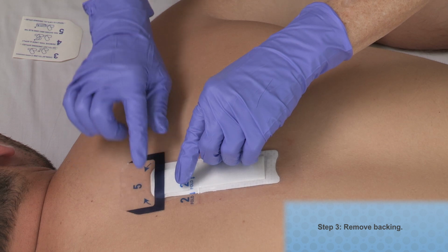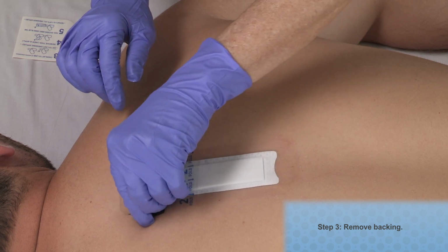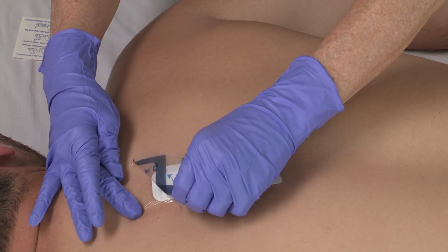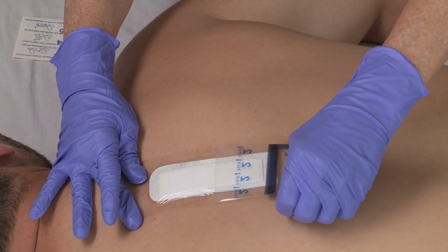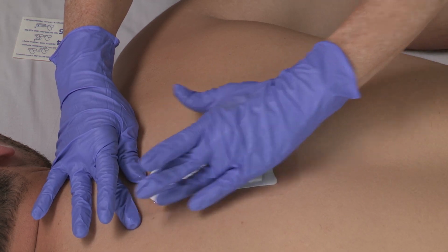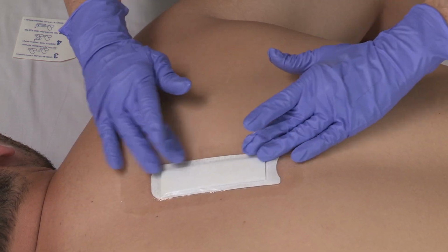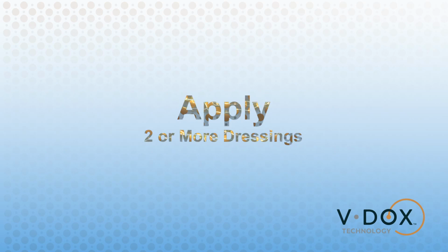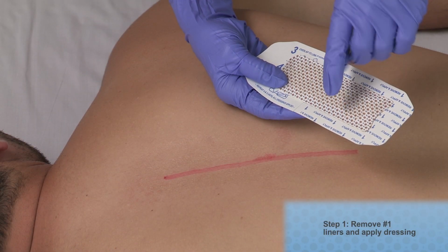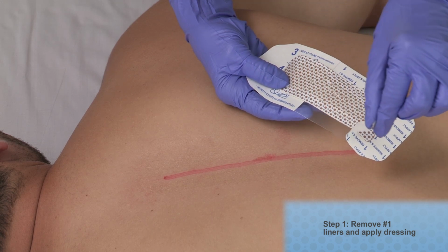Pull either blue tab back at an angle to remove the backing. Gently press adhesive down. Remove the number 1 liners and apply the dressing.